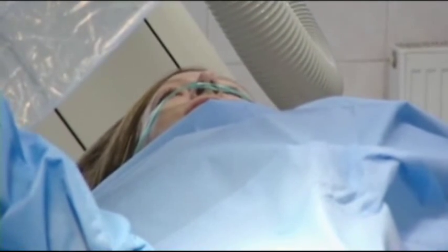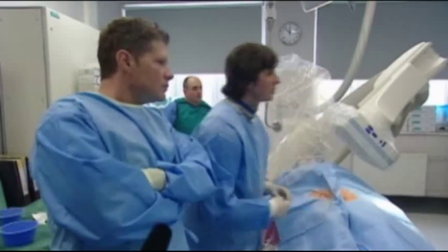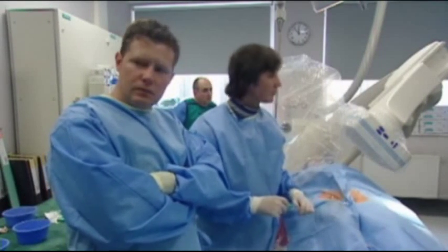Oh yes, we know. There's behind your ear. There's some pain. Yes, okay. This matches the theory that blocked veins cause blood to pool and damage the brain. Ginger's case is one of the most serious they've seen. Can you show us the reflux? Can you actually see the reflux? Yes. It shouldn't be going up. Yes, it shouldn't. It should go down.